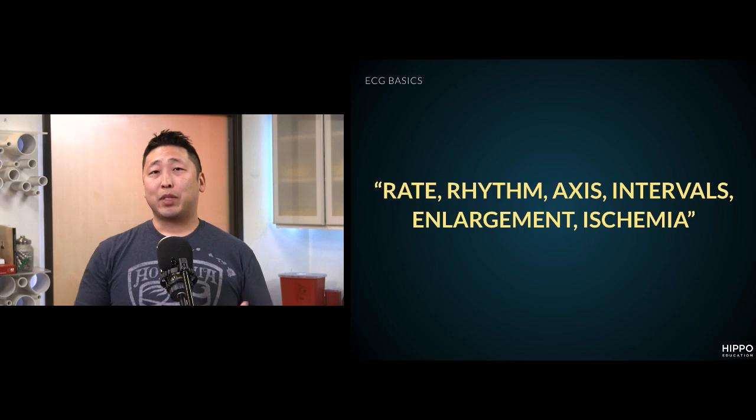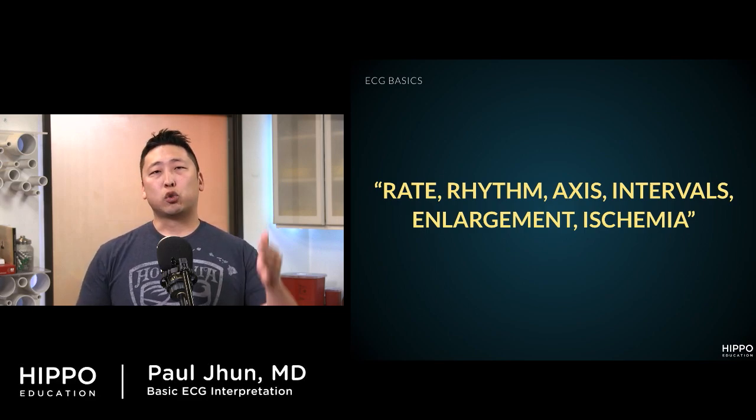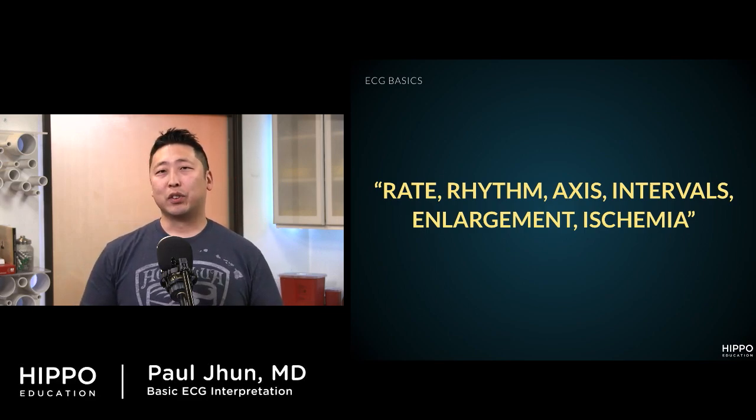So remember, the next time that you review and interpret an ECG, just remember rate, rhythm, axis, intervals, enlargement, and ischemia.